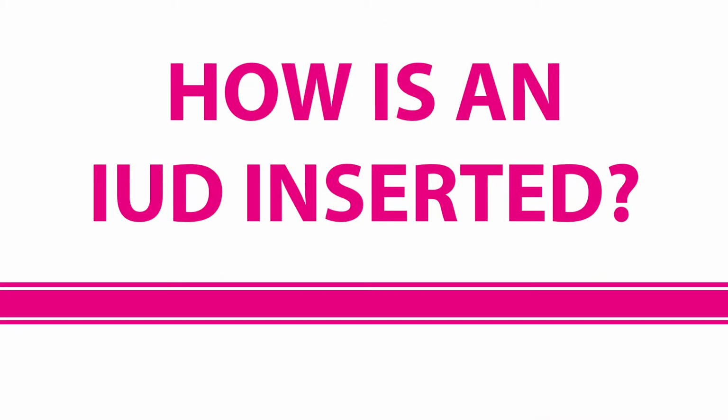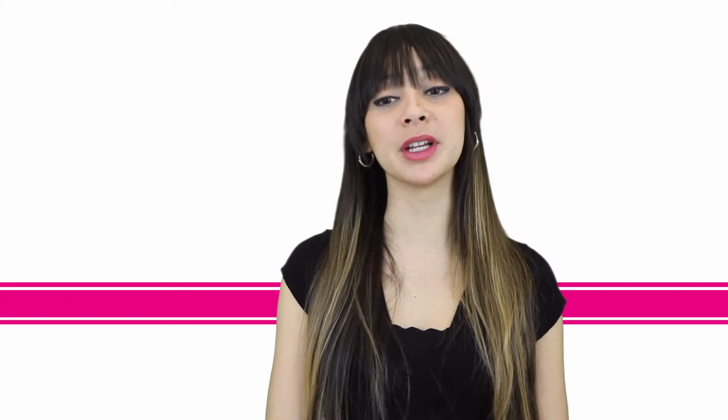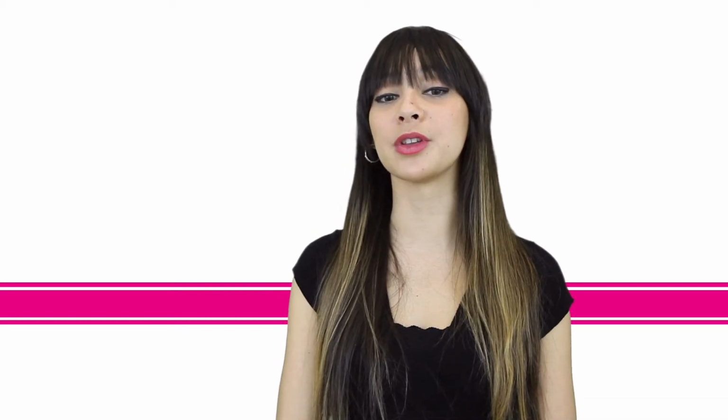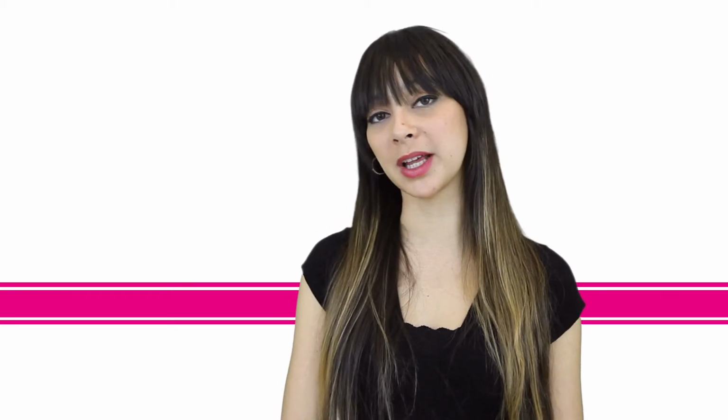How is an IUD inserted? You can have an IUD inserted by a doctor at any time, as long as you're not pregnant, and it should only take a few minutes. The IUD is put into a long, slender plastic tube and then placed into the vagina where the doctor will guide it into the uterus. It is then pushed out of the plastic tube into the uterus where it springs open and into place.